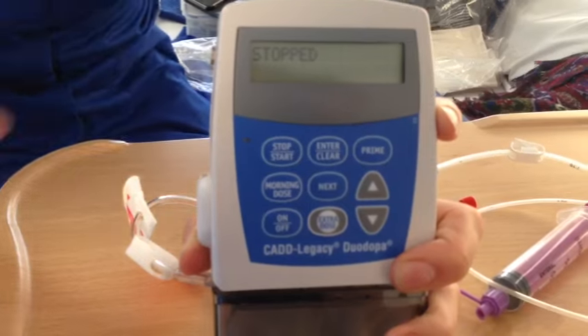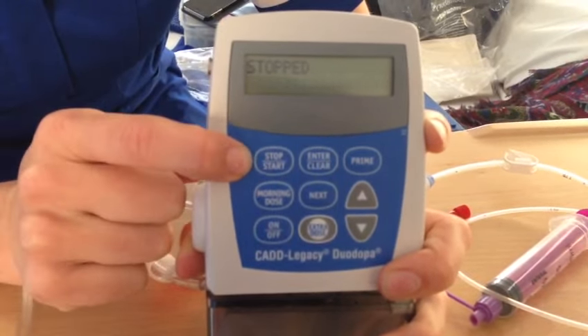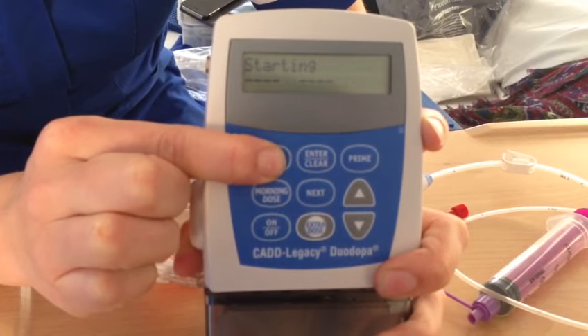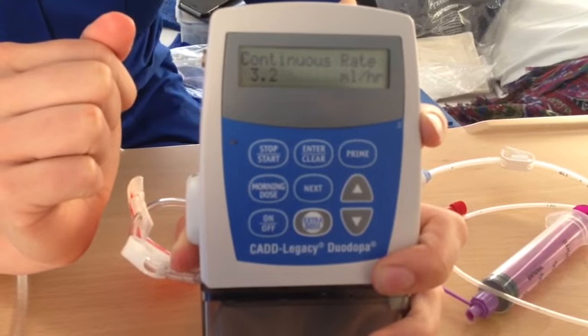You're going to press on it until you reach the primed point. When it says 'stopped' in the window, you need to start the pump using the start/stop button and again let it run through its settings.